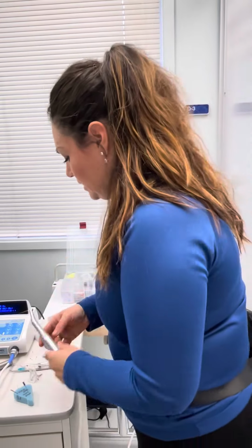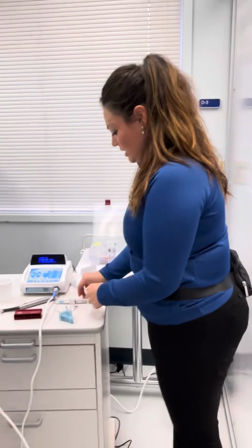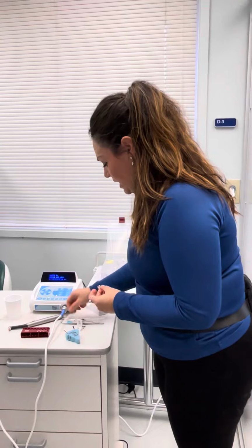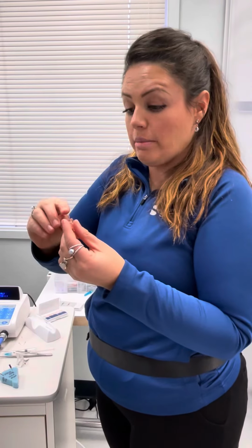Otherwise, we're always starting on the primary, and 80% of the time, this will be the only file that you need. So there's that. Assistant takes the image of the root canal. The root canal looks great. Doctor's happy with the root canal. He's going to sear it off, and he's going to do his backfill technique, or I don't know what they're going to do. They may just sear it off, pack it down, and be done with it. It's a very common way of doing it these days.